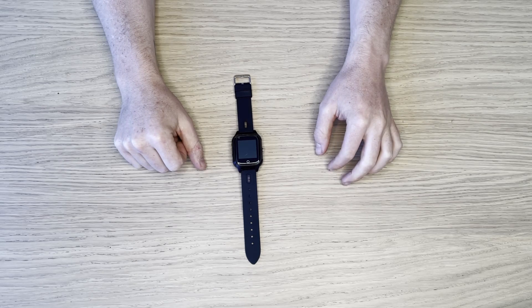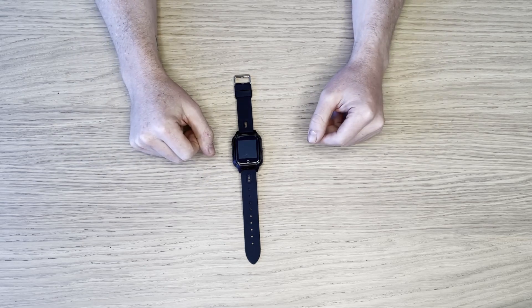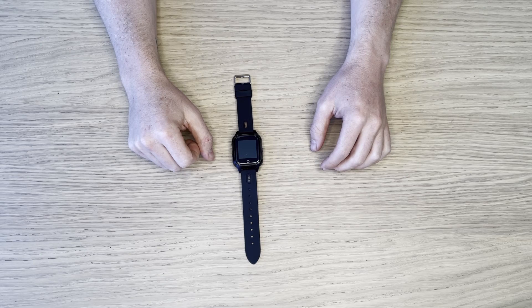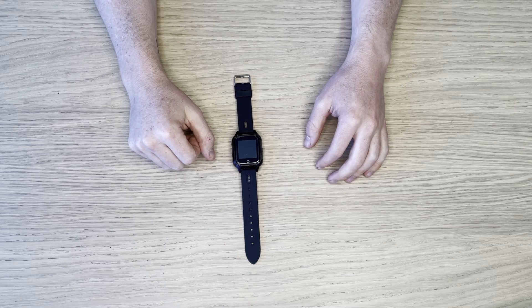We have SOS calling. We can make and receive phone calls. We can take photos on it. It obviously operates as a watch. We have some fall down alerts as well, which is a very handy one. If you do take a sudden fall, it can alert some pre-set numbers on it.